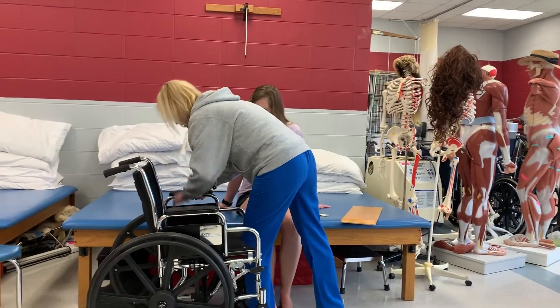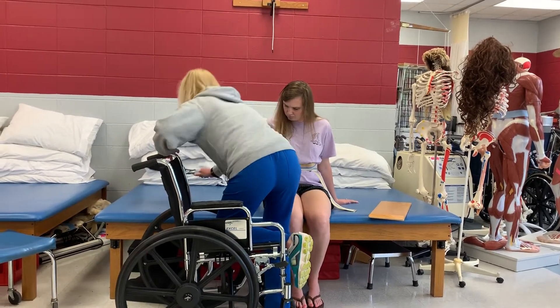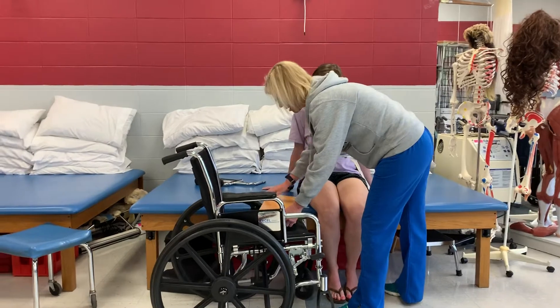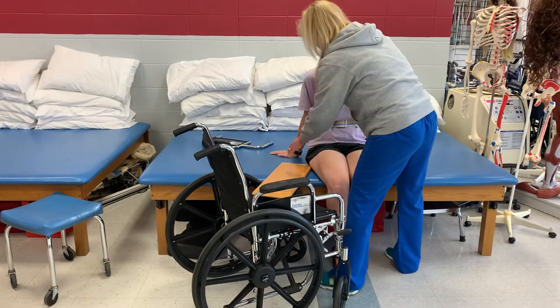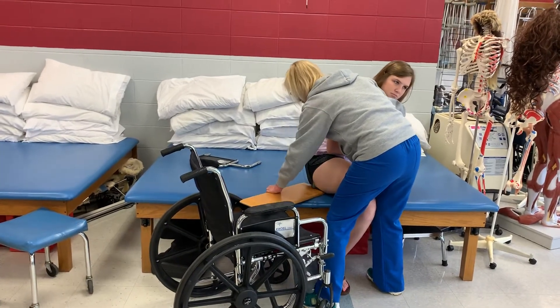We're going to take this armrest off again. We're going to put the transfer board half on the chair — turn the chair so you get a better position — and then we're going to slide it underneath the patient. We'll lift her leg up and just slide it underneath.